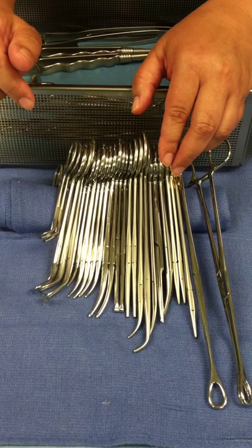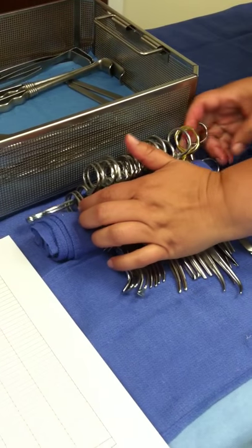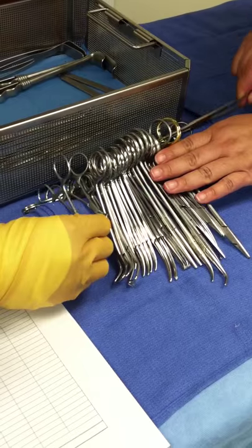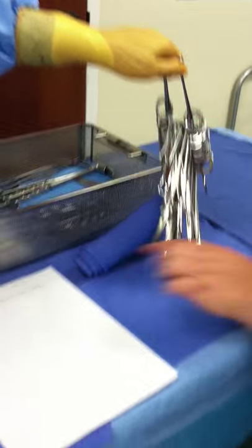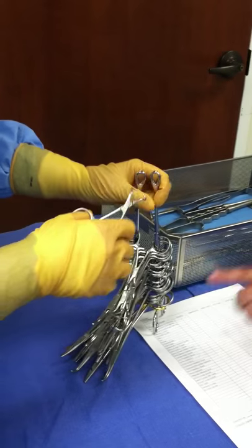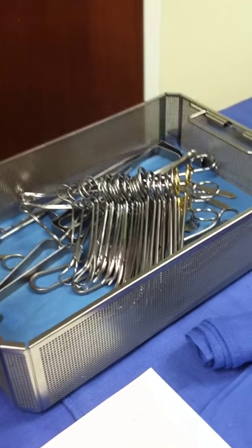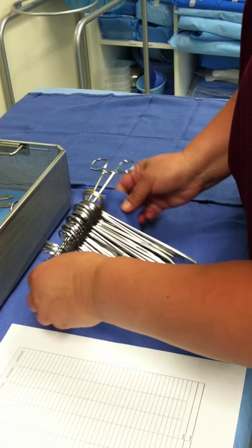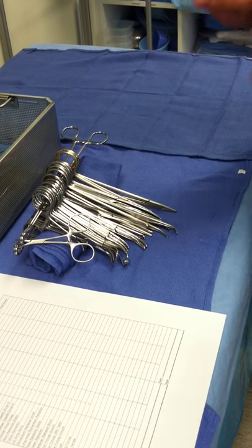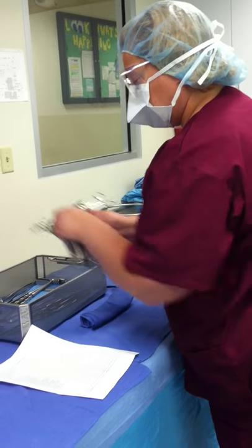Since we use our sponge sticks, you can just string in the one end and string in the other. Again, the instruments are in order according to your sheet, and the curves are all going the same way. Then you just nice and easy lay them on top of your other instruments. This way it is easy and quick for you to lift those out. This will help you cut down on your time — I cannot stress this enough. Follow your sheets. And that is our conclusion of the instrument tray for now.